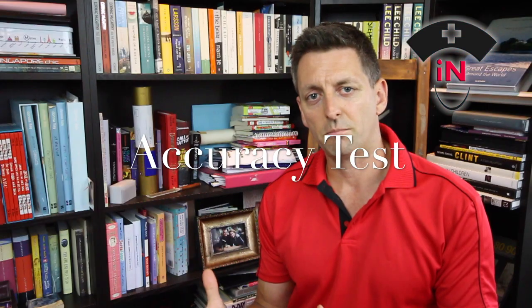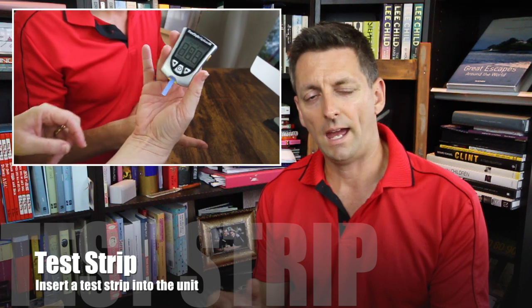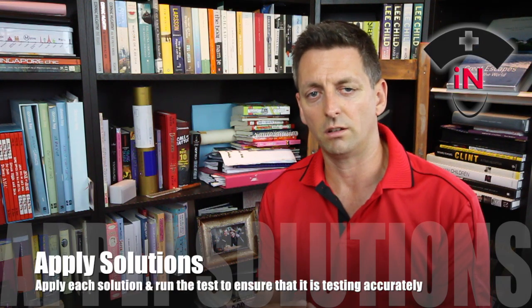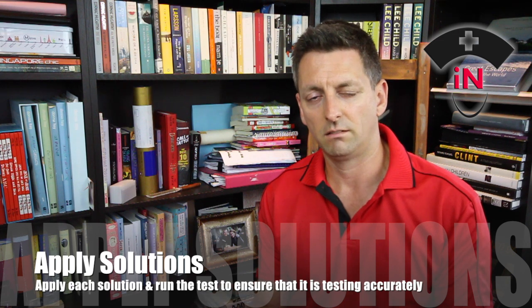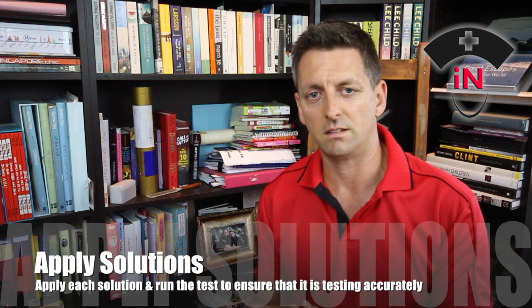The second step is to grab a glucometer test strip, put it in the bottom of the machine, and apply testing solution so you know that you're calibrating it correctly. We use a bit of low and high testing solution. Low will give you a reading that is under four, and high would usually give you a reading in the late teens to twenties sort of area, depending on what brand you use. Make sure you do that first before you start testing yourself.